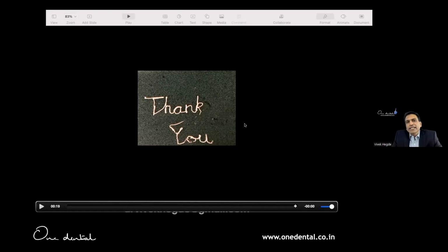Yes, the preparation. See, I can show you videos where you don't need to prepare. When they give you acrylic blocks, they show you an 8-number canal, 10-number canal, and then you prepare in the acrylic blocks to 25 or 30, right? We have done studies on that. We put a drop of colored liquid into the canal and the irrigant didn't go inside. We used a laser and fired at the entry point, and the solution was pushed into the system. That's the beauty of photon-induced photoacoustic streaming. That's called the PIPS tip. PIPS also has copies like Preciso tips, X-Pulse. Today there are SWEEPS, short wave pulses. So many of those. But if you ask me, yes, prepare the canal first.